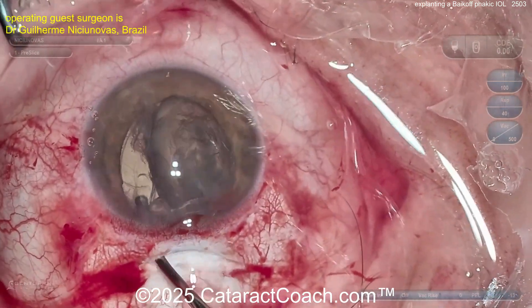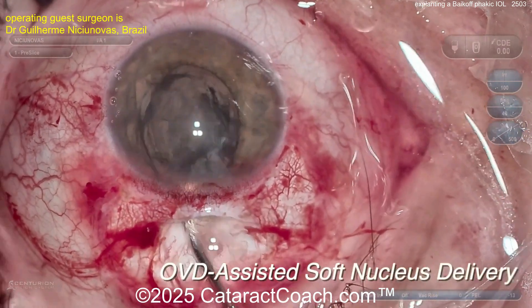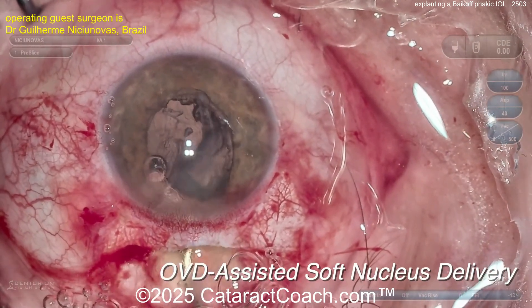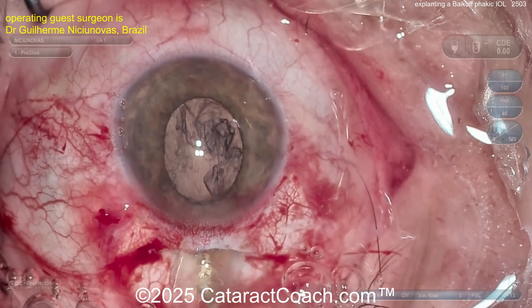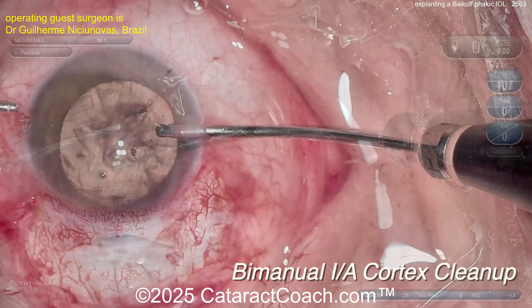Here's the nucleus — you can bring that thing up. It looks pretty soft; you can probably just suck it out with a FACO probe. Another option is to put a suture in and split the incision, making it smaller, then go in with the FACO probe to one side of the incision. But here we go, just aspirating this nucleus out — pretty soft, comes out easy.